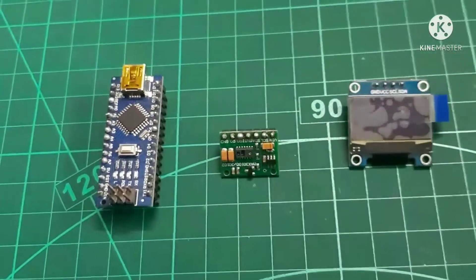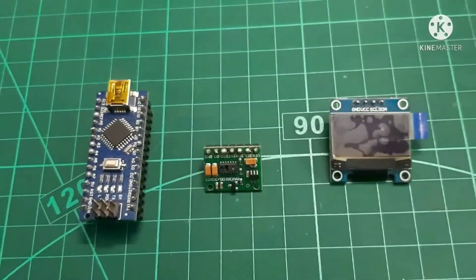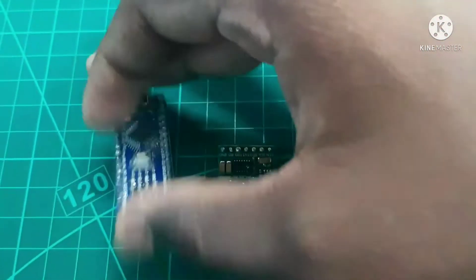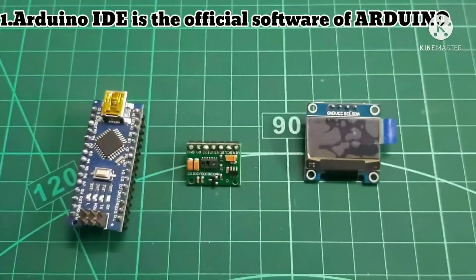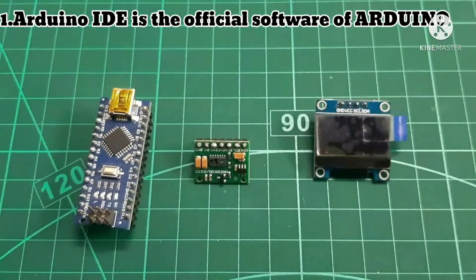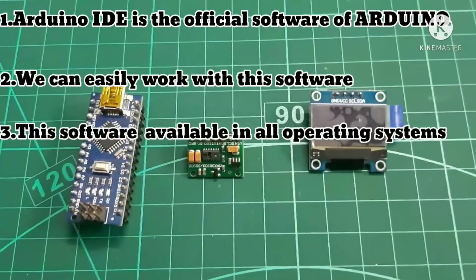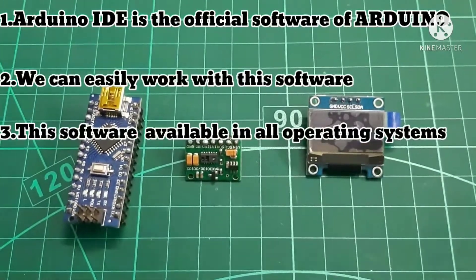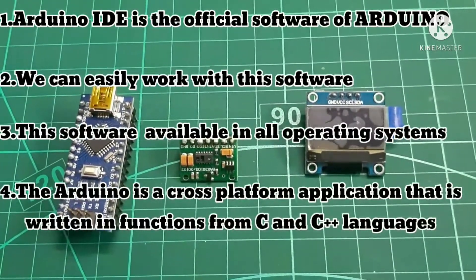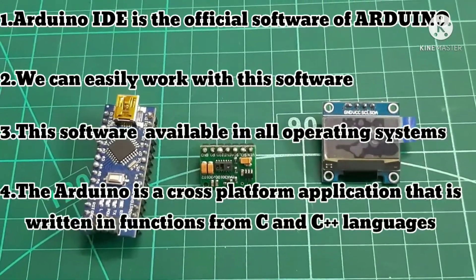Before going into the project we should know about Arduino IDE software, because we need to program the Arduino Nano using Arduino IDE software. Arduino IDE is the official software of Arduino and we can easily work with it. Arduino IDE is available on all operating systems like Windows, Linux, Mac OS, etc. It is a cross-platform application written in functions from C and C++ languages.